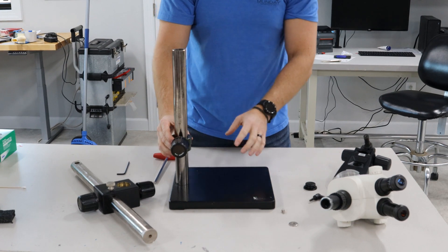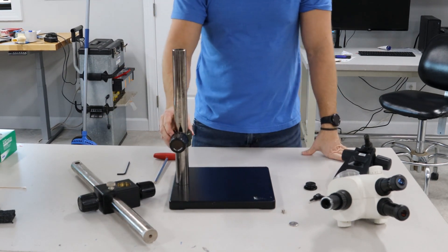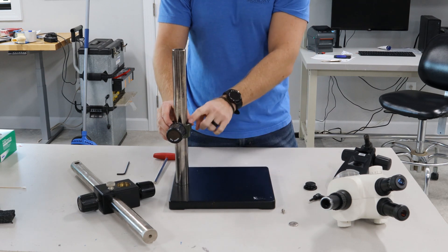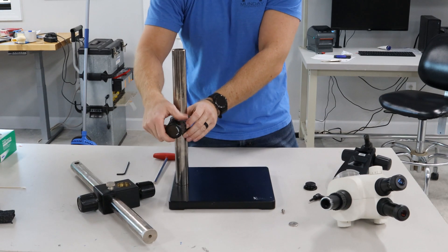These runaway collars are really nice — if that knob that I was just turning gets loosened, the scope cannot fall and crash into the table or the specimen because of this. It'll catch it. So you want to set that right underneath where this is set.